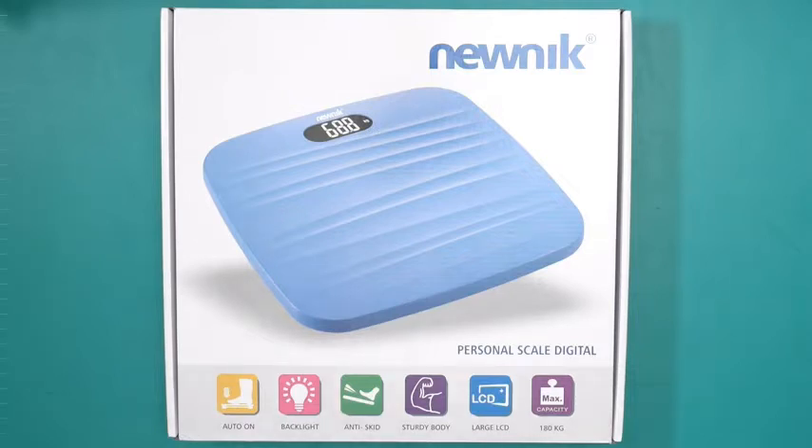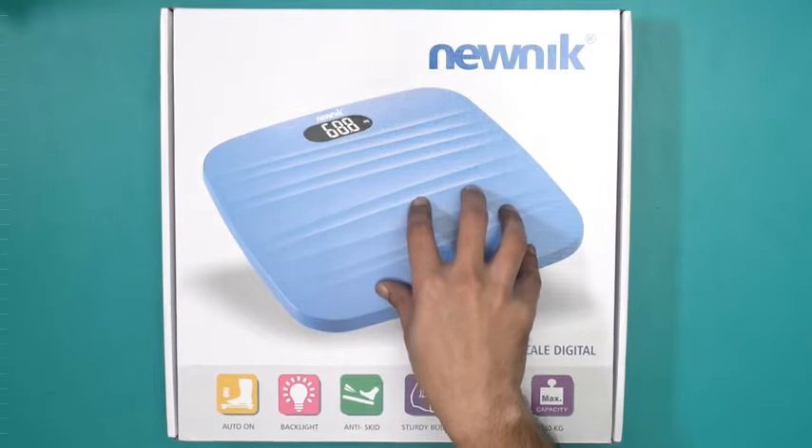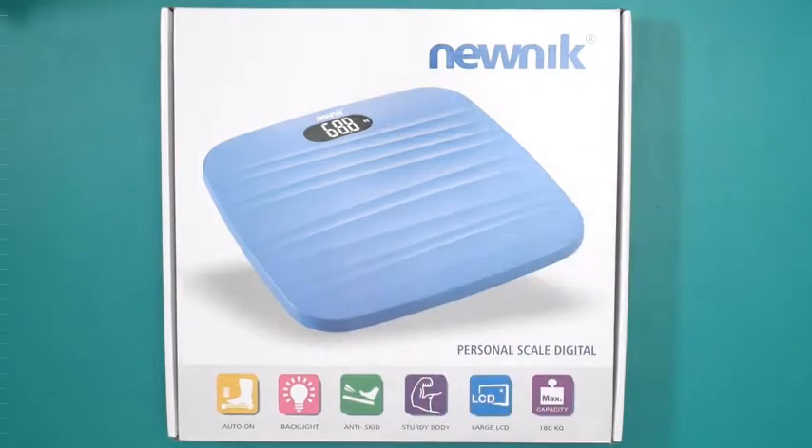Hello and welcome to the unboxing of the Newnik PSE201 Personal Scale Digital. There's an image of the weighing scale right on top. This is a weighing scale that you use for personal use at home, in a bathroom, or even an office.